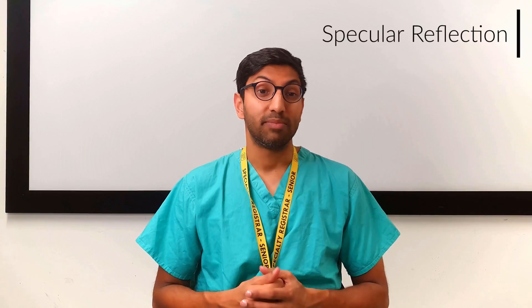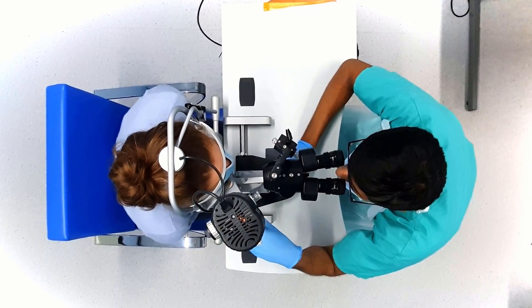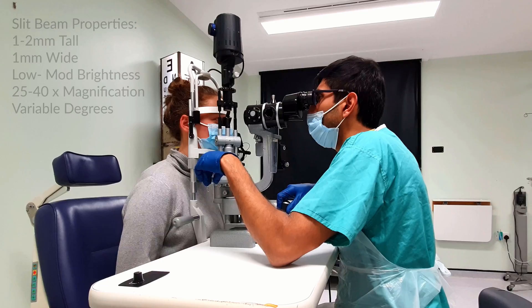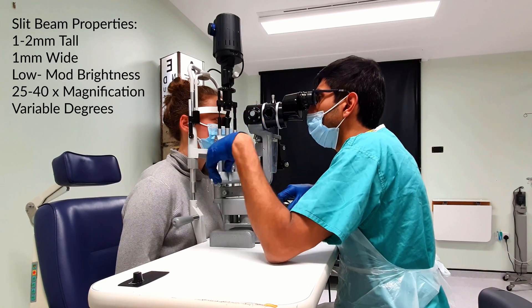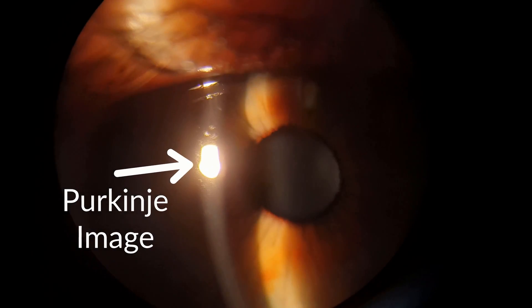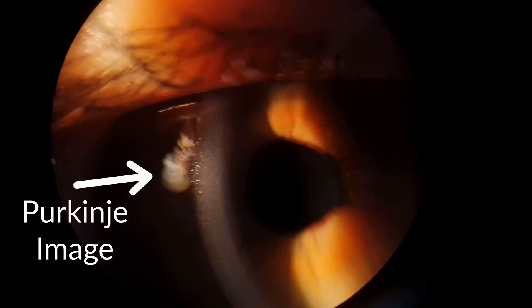Specular reflection. This technique is mainly used to observe the corneal endothelium but can also be used to see subtle changes on the surface texture of the conjunctiva, tear film, anterior cornea or a contact lens. To look at the corneal endothelium, start with the optical section of the cornea. Adjust the illumination angle until you see a bright reflection, ensuring the angle of incidence equals the angle of reflection. You can move the observation arm if required. This is the corneal Purkinje image. Adjacent to this bright reflection, focus on the slightly dimmer area and increase your magnification to around 40. You can see the mosaic pattern of the endothelial cells. Discontinuities are highlighted in an otherwise smooth reflective surface and it can be used to look at the corneal endothelium for corneal guttata.